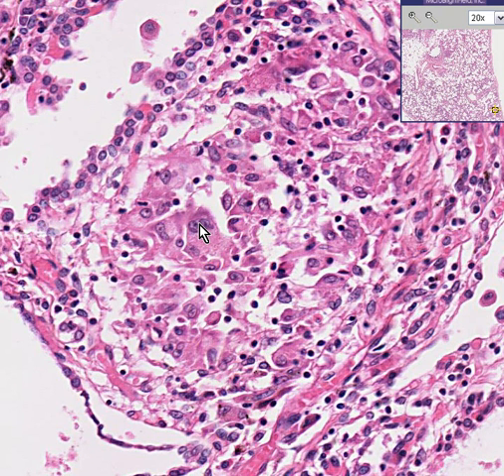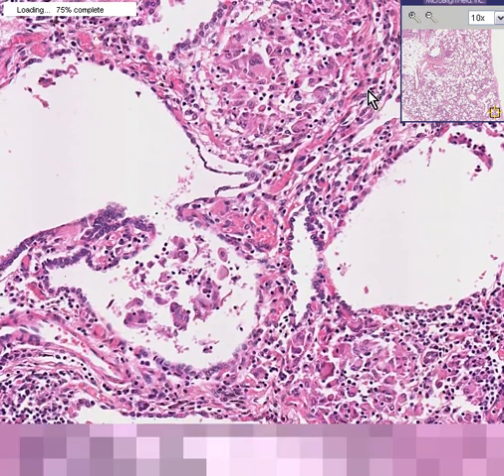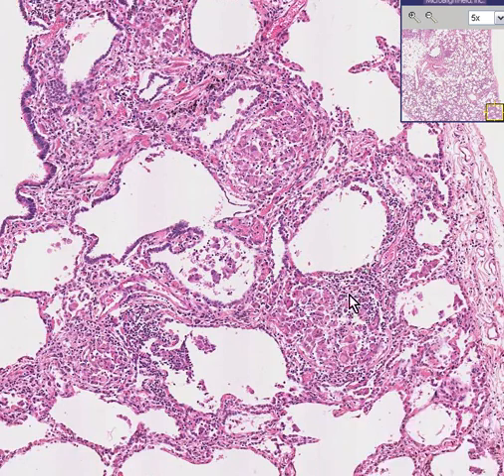macrophages are fusing to form multinucleated cells. These cells are larger than normal because of their fused cytoplasmic mass, so we can certainly call them giant cells. We can also see that there's a little peripheral cuff and some admixture with lymphocytes as well. We could, by all criteria, very, very safely call these granulomas.